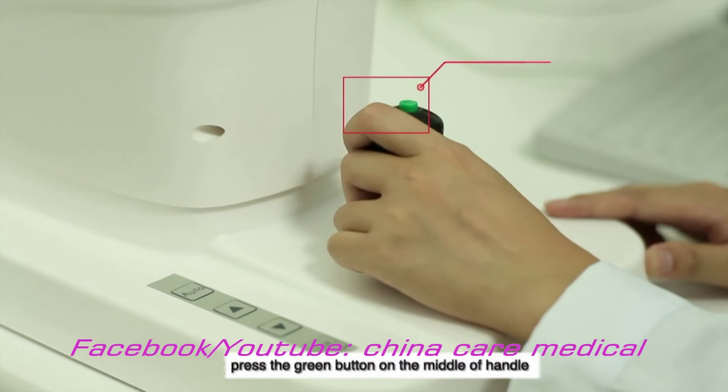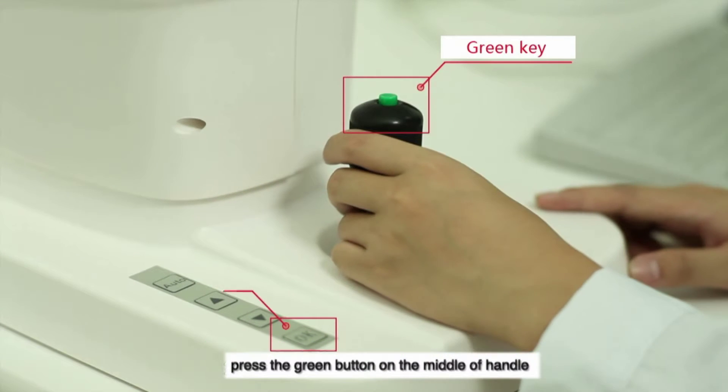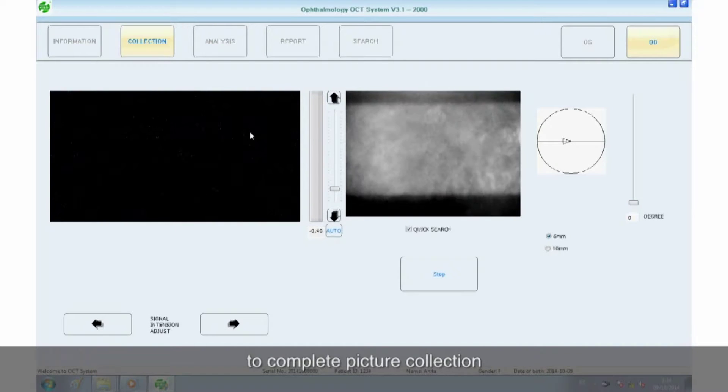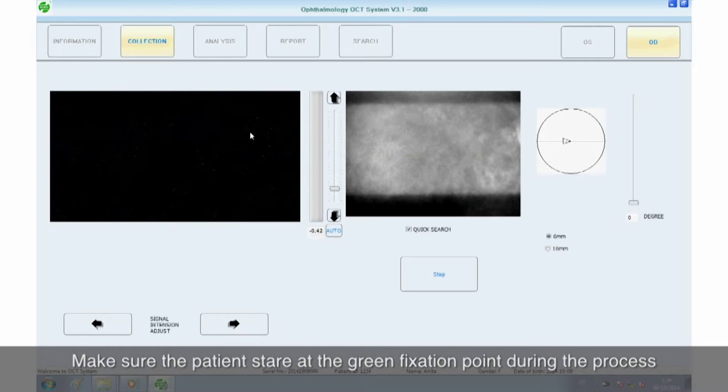Step 4: Press the green button on the middle of handle or OK button to complete picture collection. Make sure the patient stares at the green fixation point during the process.